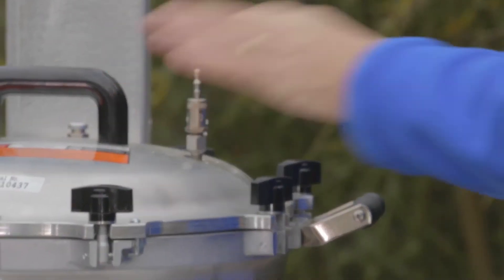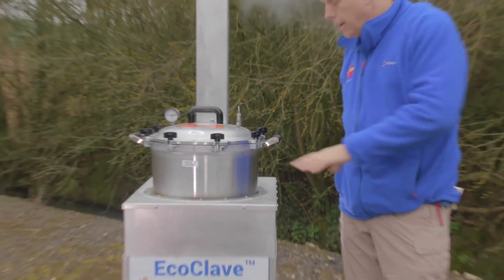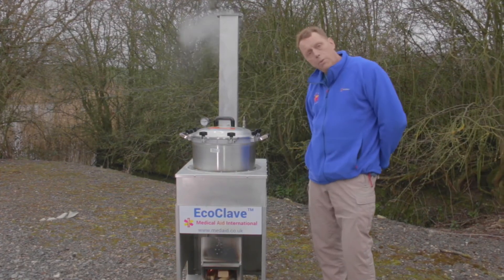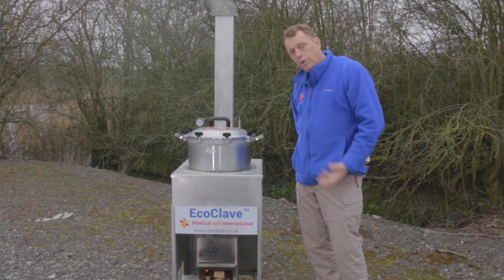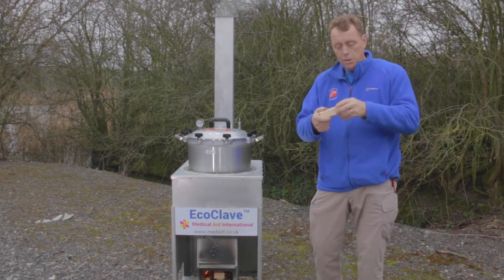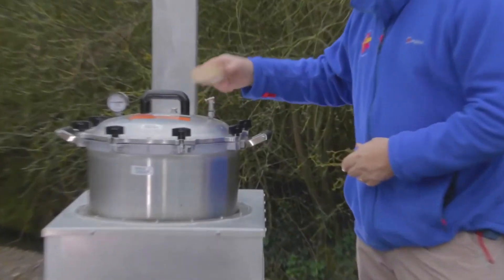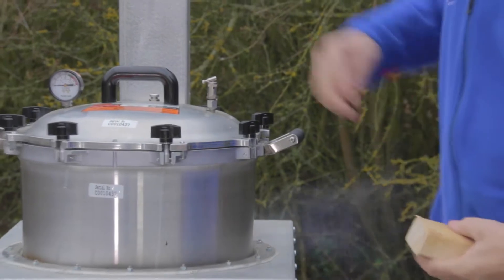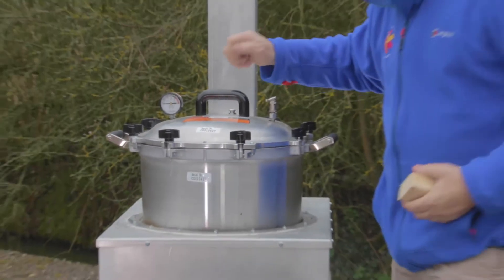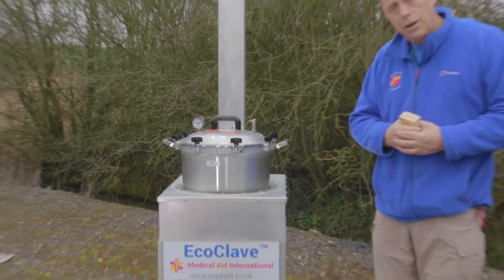At that point we will shut the valves and allow high pressure steam to build up. As you can see, this valve here has steam coming out of it consistently. When you have steam coming out consistently, that means the inside of the autoclave drum is now full of steam. Therefore what we now have to do is close the valve in order for it to build up high pressure steam inside — that is how we kill the microbes. We can close it using any piece of wood or a penknife. So we've now closed the valve and the pressure gauge will start to increase, reaching the green area where sterilisation is taking place.